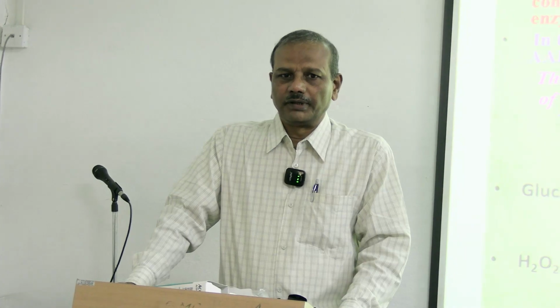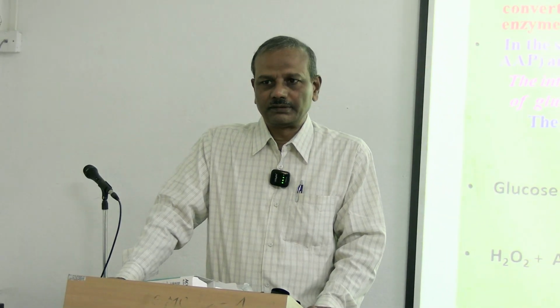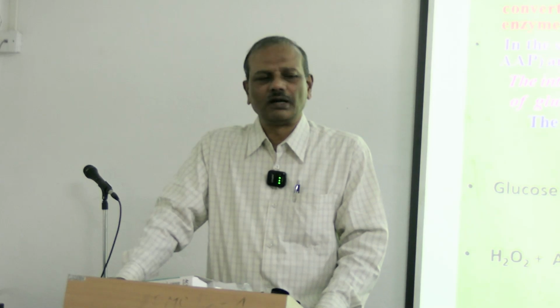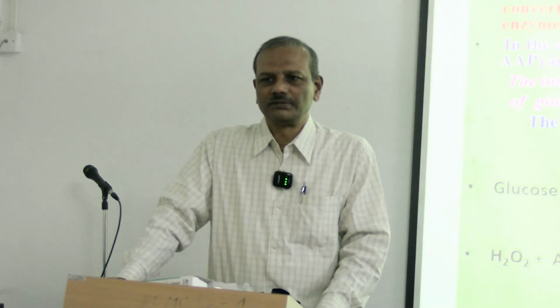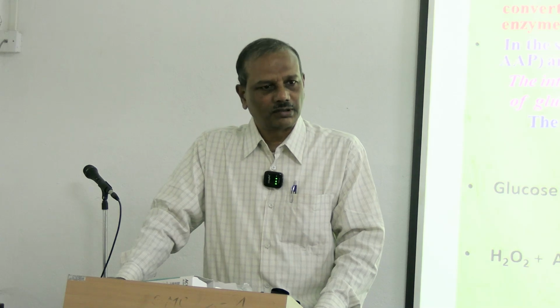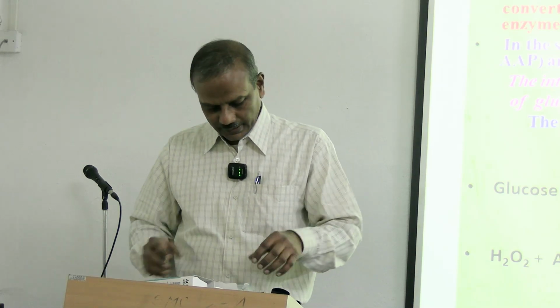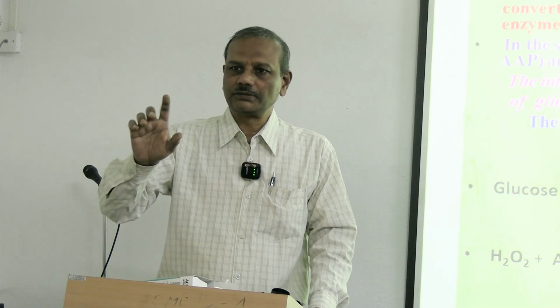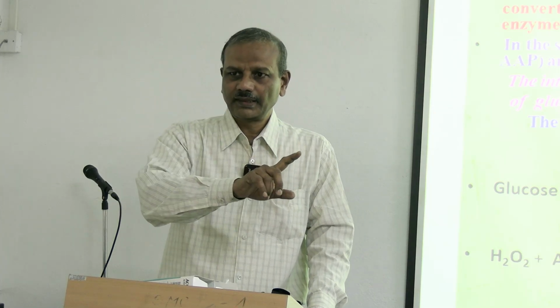In the laboratory, everywhere from the middle of the 1990s, that is 1995 onwards, almost all laboratories are not doing whole blood. They are measuring glucose in plasma. So they draw the blood and collect it in the test tube, which I brought yesterday. That test tube is centrifuged.